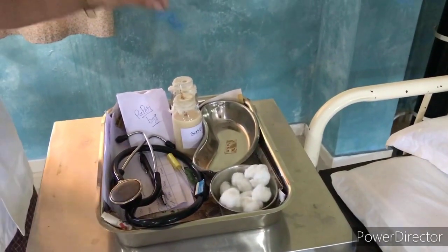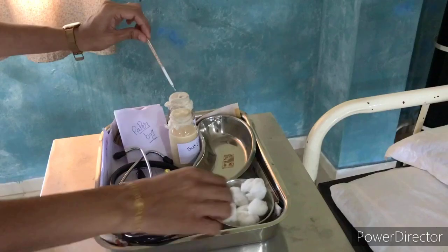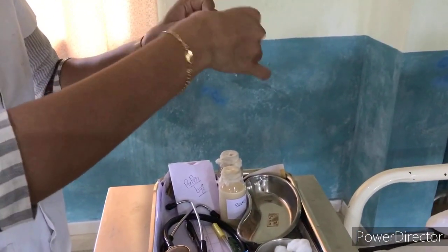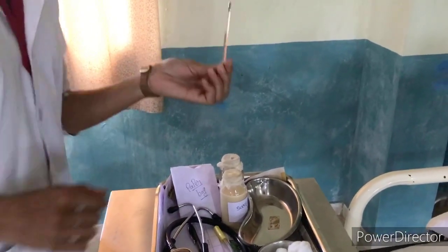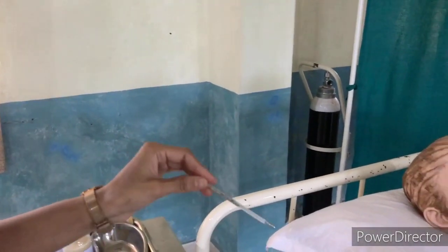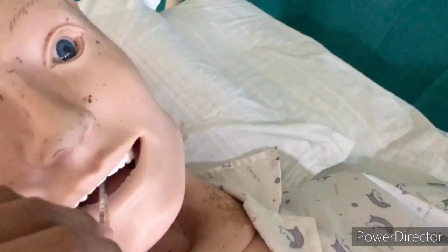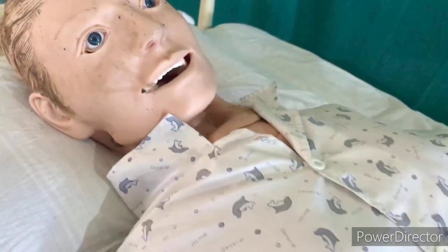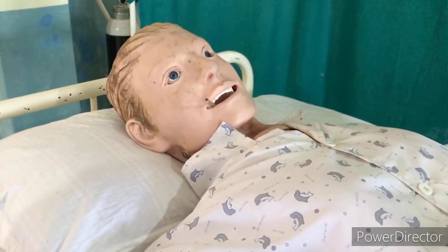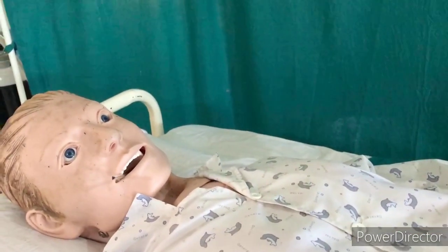Steps of procedure: Wash hands. Remove the thermometer from antiseptic lotion and rinse it in clean water. Wipe the thermometer with a clean cotton swab from bulb to stem with a rotating movement, then discard the cotton swab. Shake the thermometer before use with a quick movement of the wrist. Ask the client to open his mouth and place the thermometer under the tongue. Ask the client to hold the thermometer by closing the lips and not to bite. Place the thermometer in position for 2 minutes.